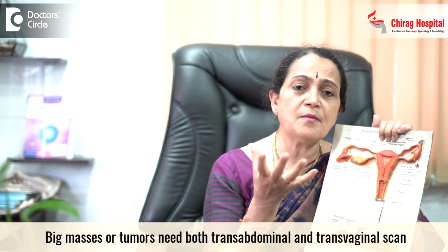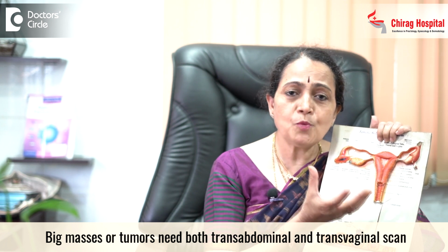But when there are some masses or tumors which are very huge, we cannot assess those only with the transvaginal scan, because it will give us limited access. So in those cases we have to depend on both the transabdominal as well as the transvaginal scan. That is what I wanted to explain about transvaginal scanning and its advantages.